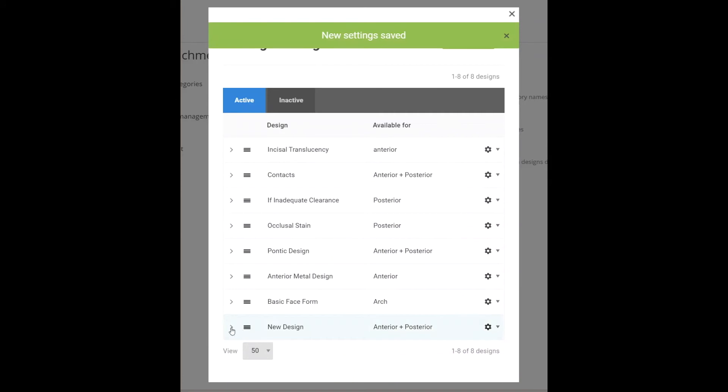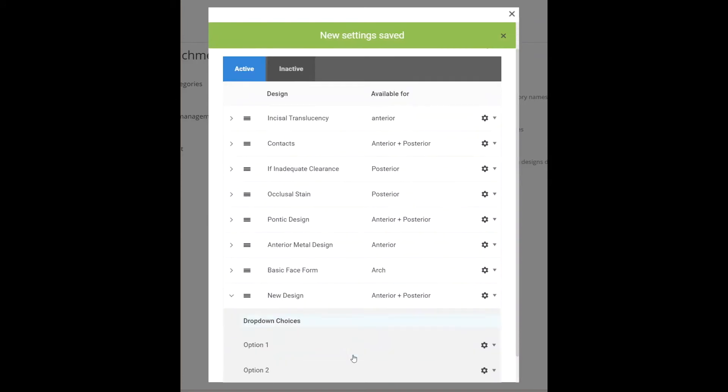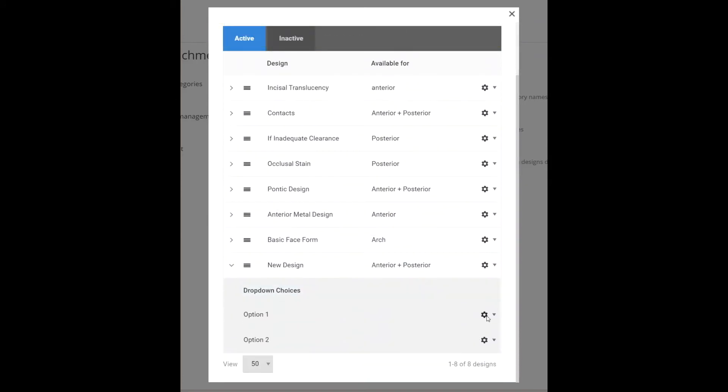Each one of these options can be added as an additional feature if you want to charge for that design option.